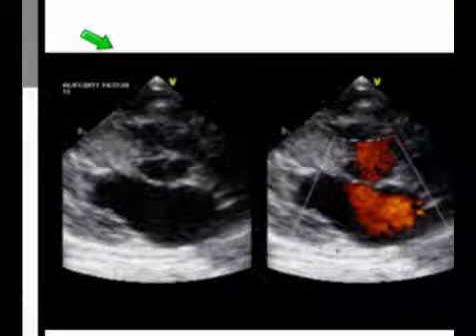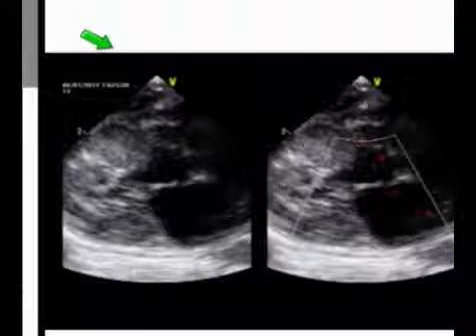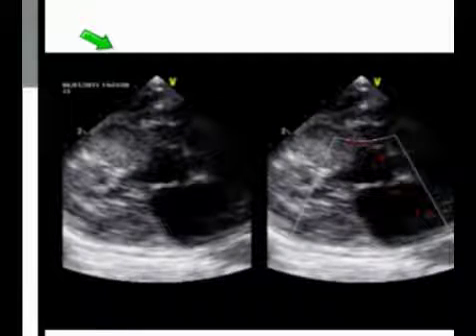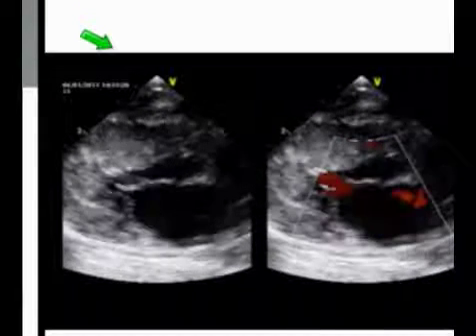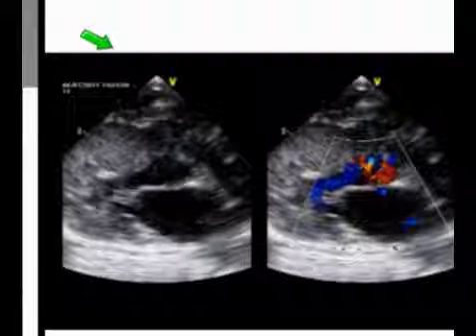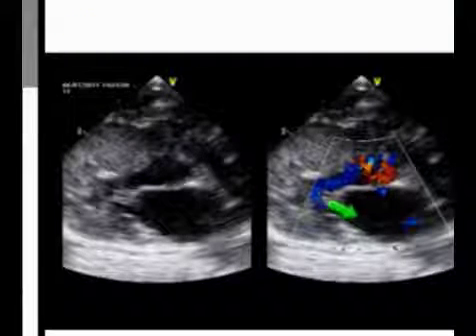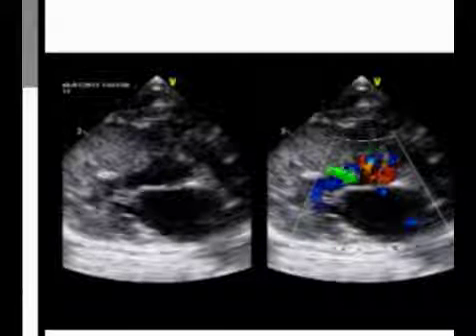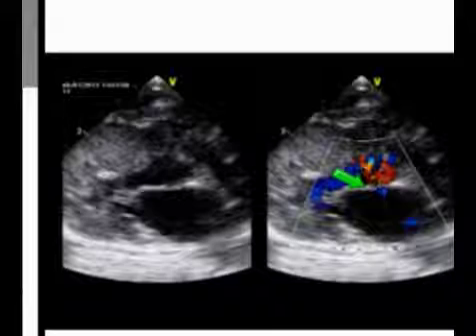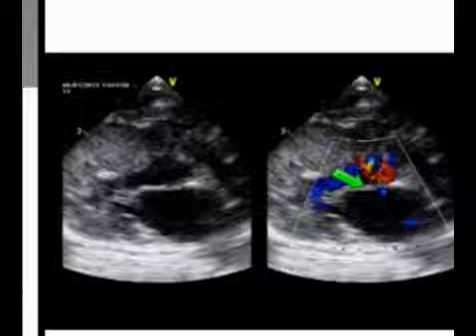Okay, so let's play that again. By freezing it, what I want to show you is that here's our jet of mitral regurgitation and here's our dynamic subaortic stenosis. This cat would have quite a significant systolic murmur, probably at least a grade four, judging by the amount of turbulence there.